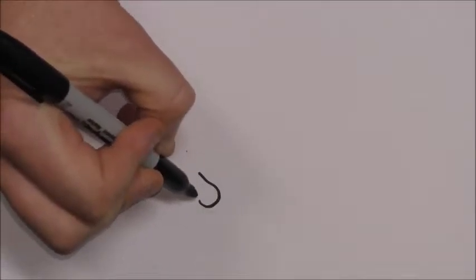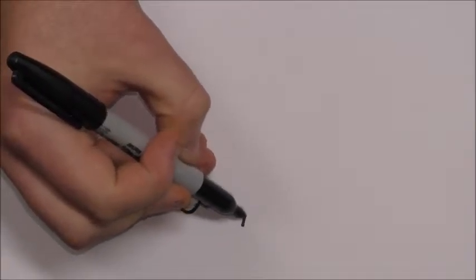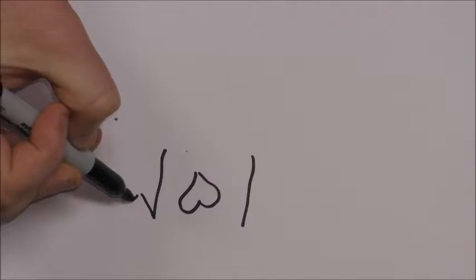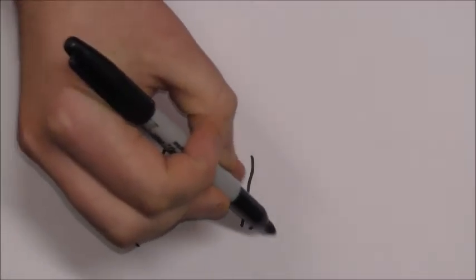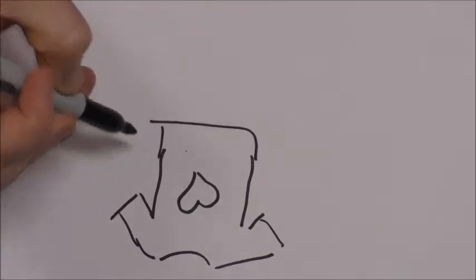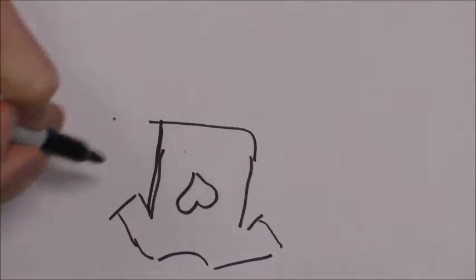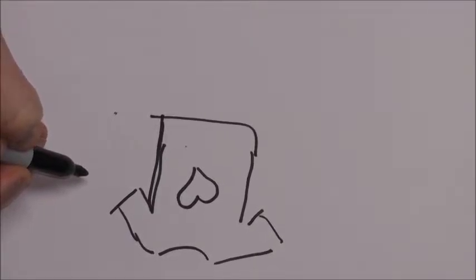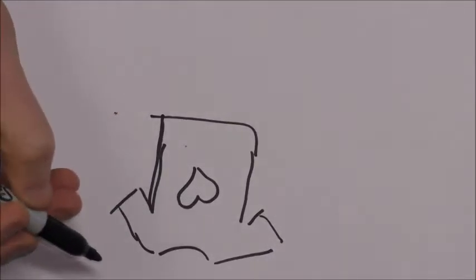So if we think about the heart, we'll just draw it like this. In the middle of the chest, and this is a really bad drawing of someone, and their heart's sitting in the middle of their chest, then the first important thing to do is to understand lead placement.